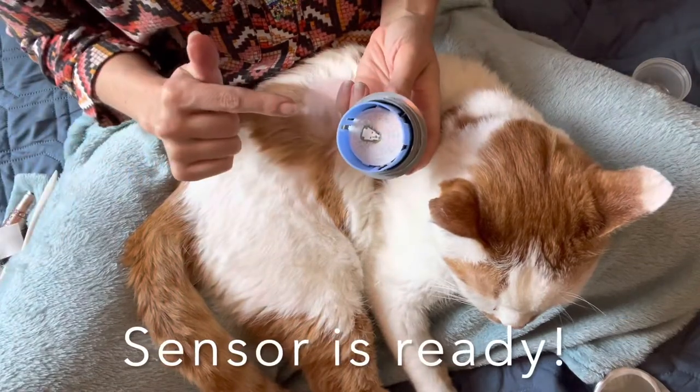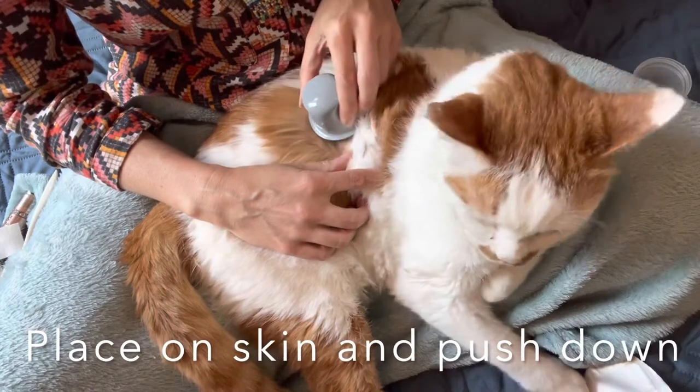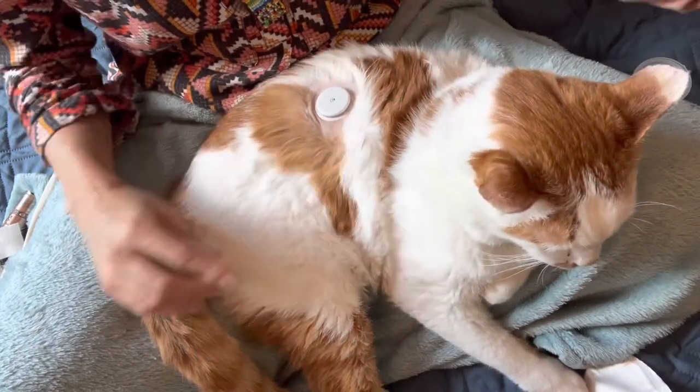Now there's a needle ready to go. Just push. And it's installed.